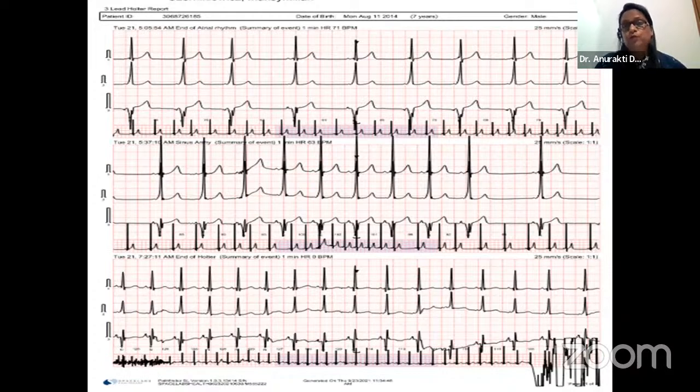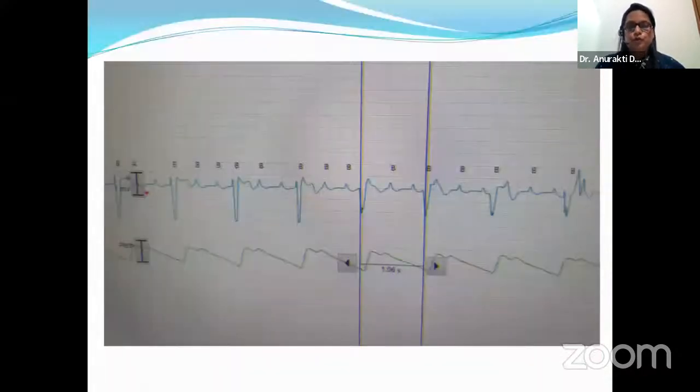So sometimes you have to make decisions on a case to case basis. So the patient had loss of AV conduction at 10 days, but regained it after 2 days. But here we had already planted the pacemaker by then. But the guidelines say, yes, you always have to put one, because the AV block can come very late, after 3 years also. So you have to monitor and you have to do a continuous Holter recording to document.